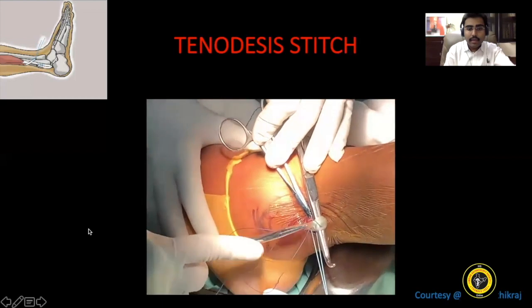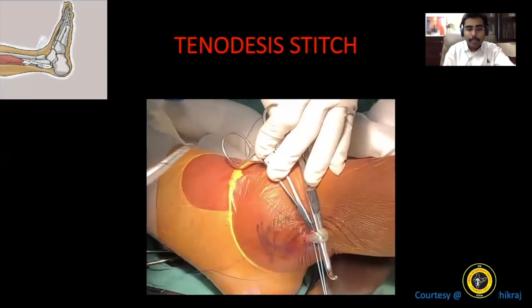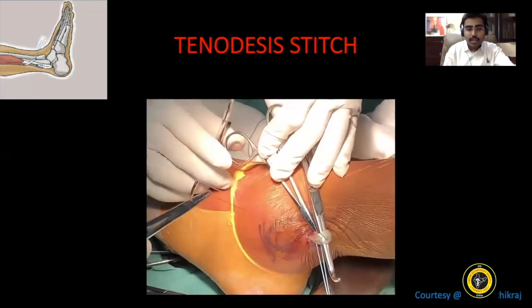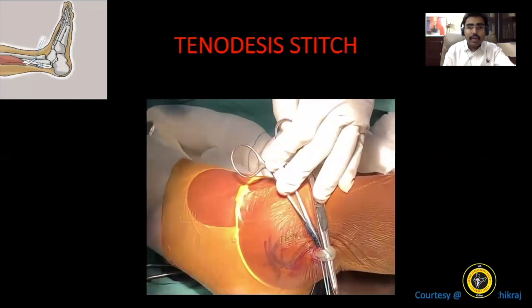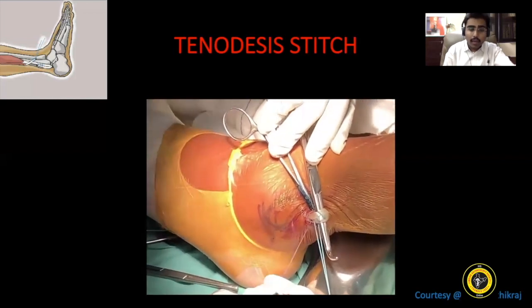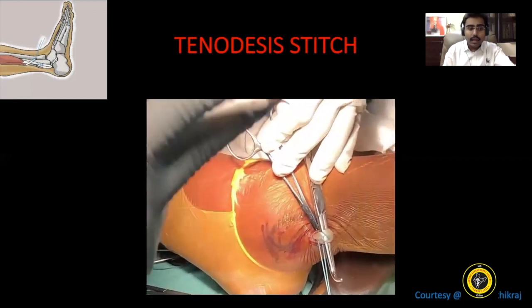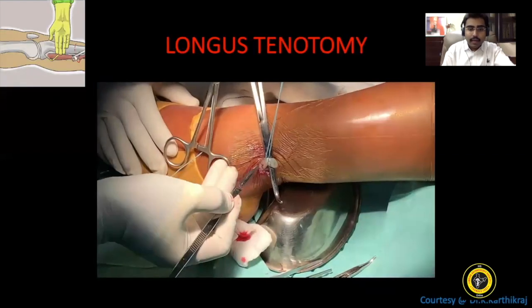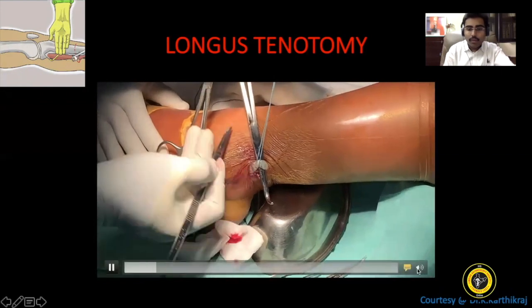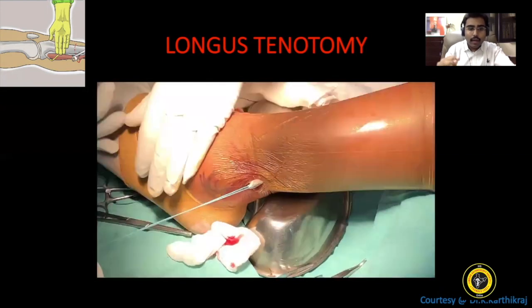This is the second stitch back and forth to create a kind of circumferential loop and a sturdy tenodesis stitch. Now, the question of whether the tenodesis stitch is a necessity is not being tested, because we have journals and papers telling that even without a tenodesis stitch, the functional outcome stays unaffected. But in my personal regard, I always find it comfortable going ahead with the tenodesis stitch. Once that is done, I'll mute the video. The important stuff is just doing the tenotomy above the tenodesis stitch.